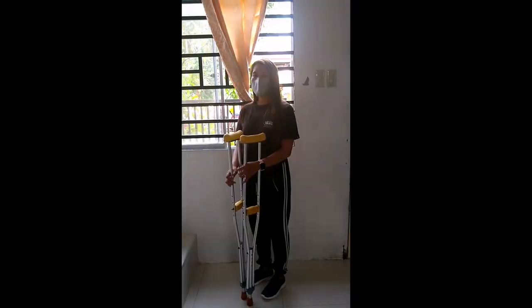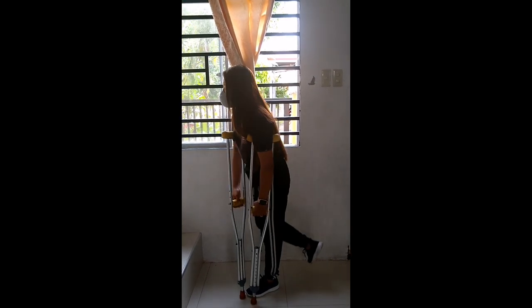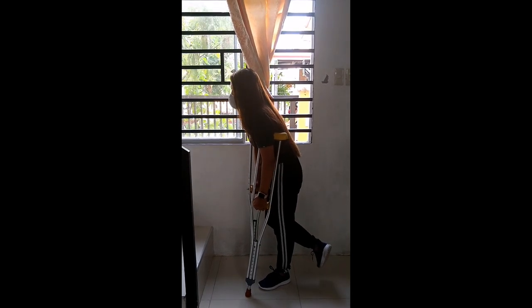Ang next way natin ay yung pag-akyat ng sampa. Maupunan mula yung good leg nyo. Sumunod yung crutch. And then, sunod yung bad leg.